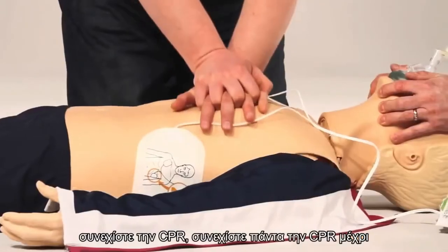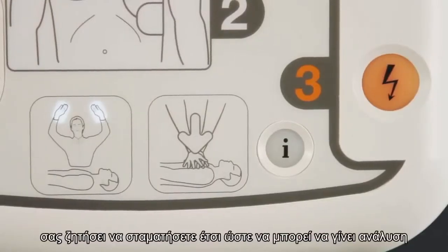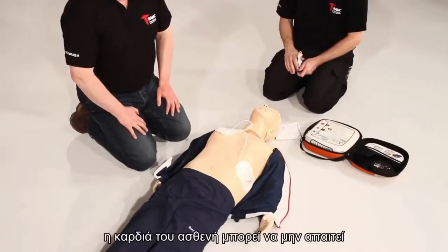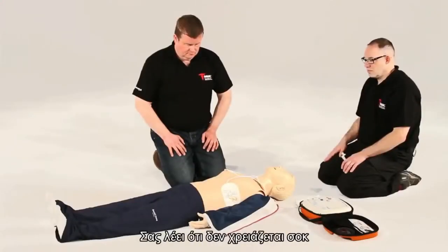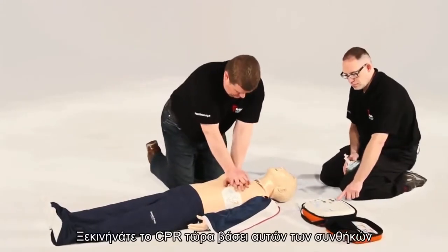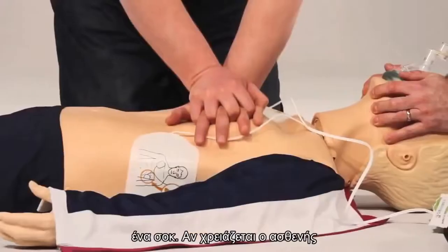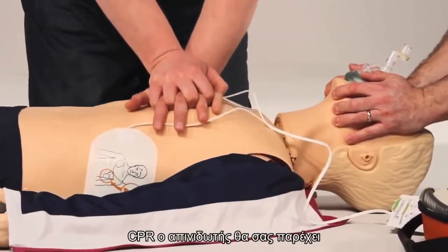Always continue CPR until either the patient wakes up or the AED prompts you to stop so it can reanalyse — usually every two minutes. At times, a patient's heart may not require a shock. In this instance, the AED will state 'No shock advised. Begin CPR now.' In these circumstances, it is impossible to accidentally administer a shock. If the patient is showing no signs of life, you should immediately start CPR.